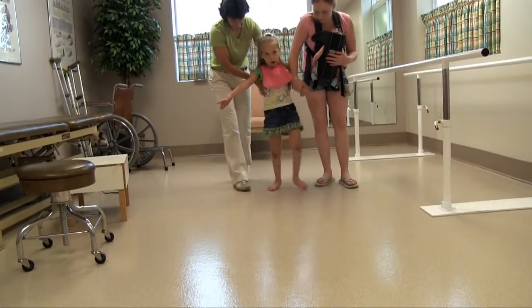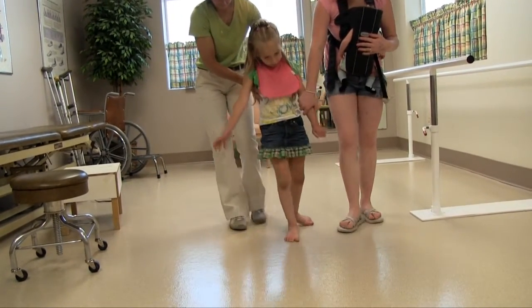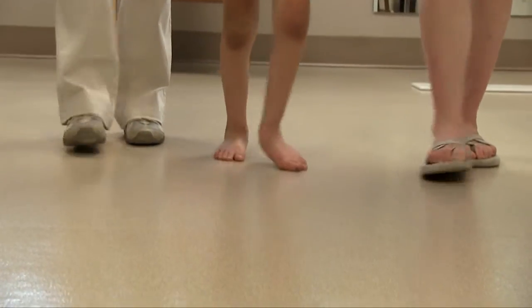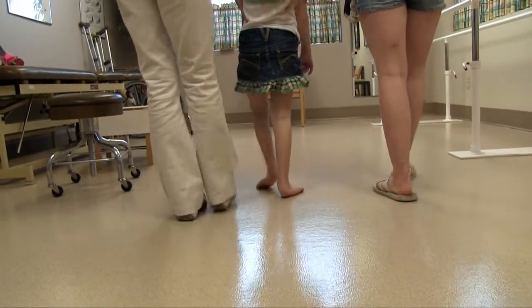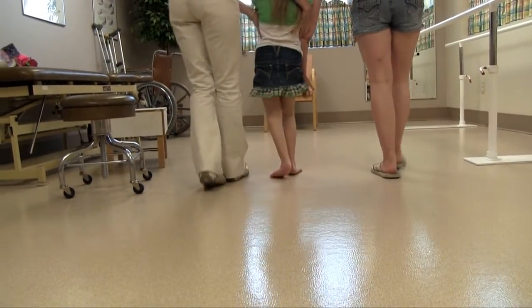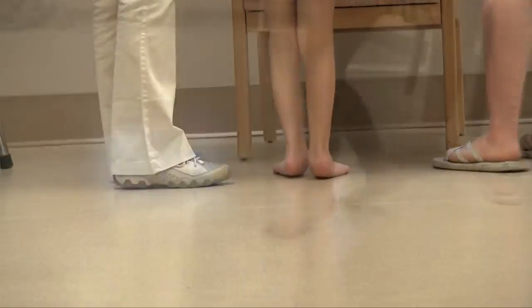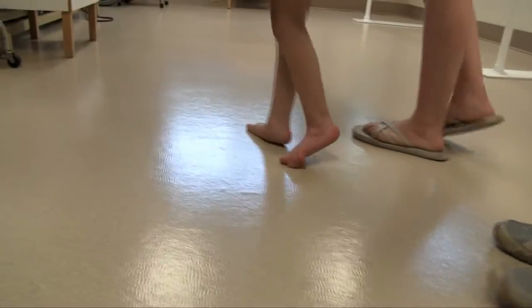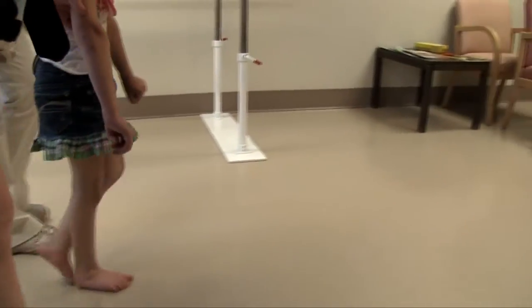Here Summer is at age 7. She's still not an independent ambulator. She does walk with handheld assist. Her feet are closer to the ground. She still has some inconsistent toe walking and she exhibits a lot more pronation now that she's gotten a little older and a little heavier. Her left side is a little higher tone than her right, but as you can see, the upper extremities are still quite involved.